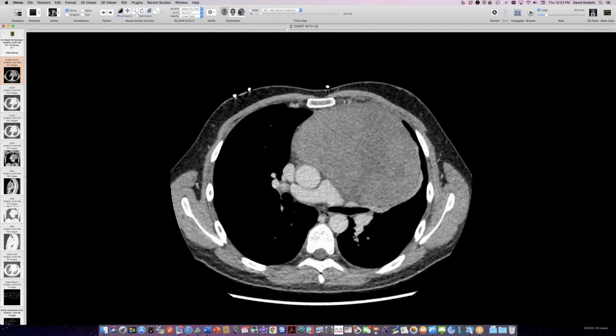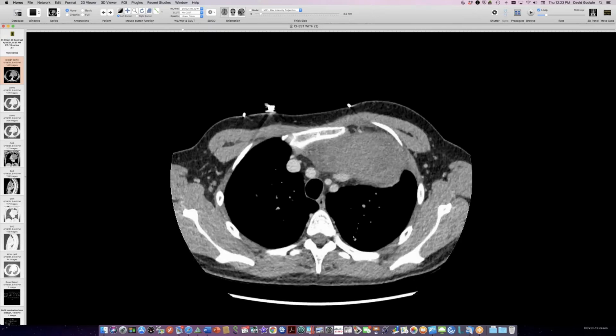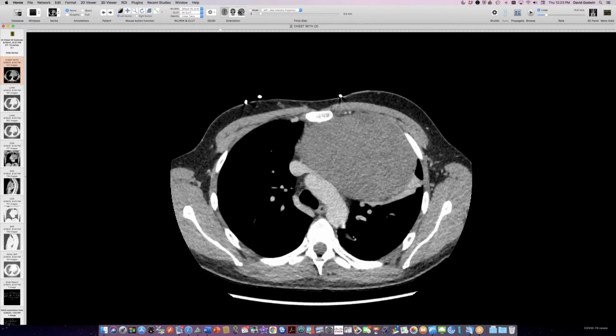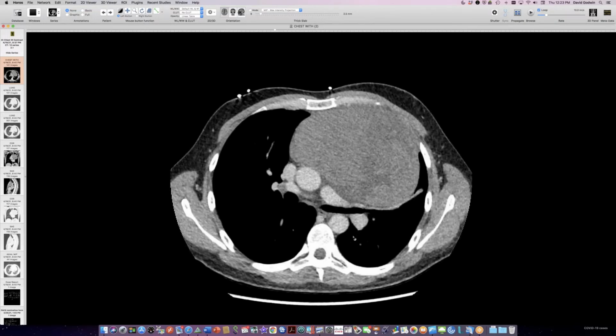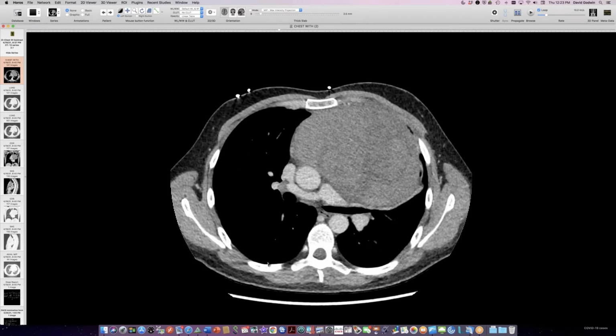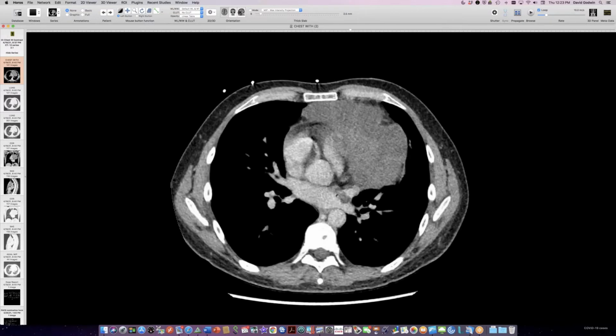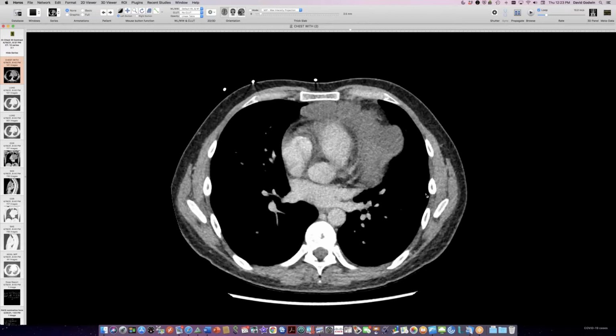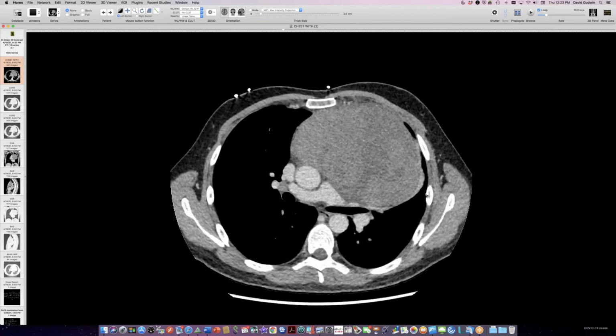So usually it's a disease of even younger people, but I've seen a number of these Ewing sarcomas or PNETs in patients into their 20s. So it's not out of range. So pretty impressive mediastinal mass. I don't think that would have been on my differential, but no, I thought it was going to be a germ cell tumor given its rapid growth. But I think another good pearl is anytime you see a big mass in the chest, always include sarcoma. Right. Especially when it's growing rapidly too.